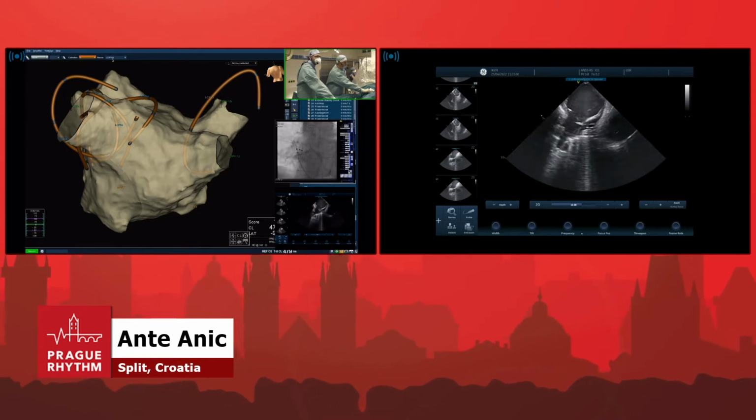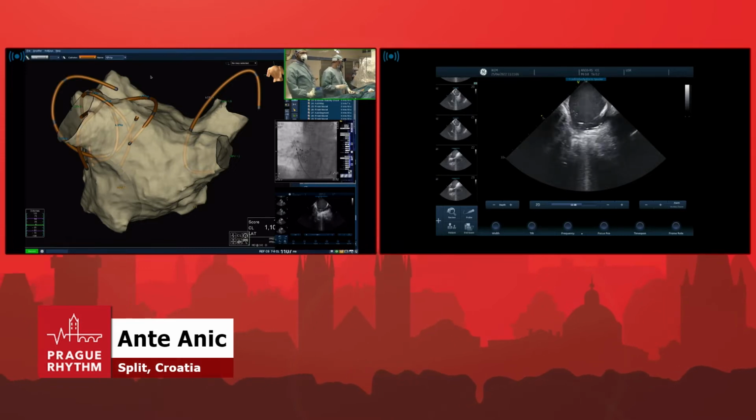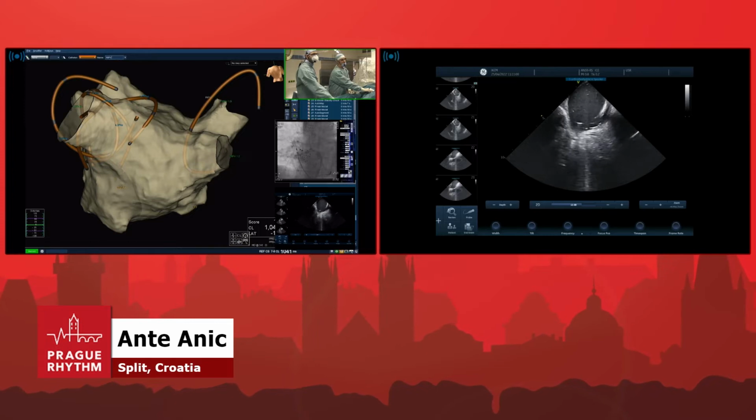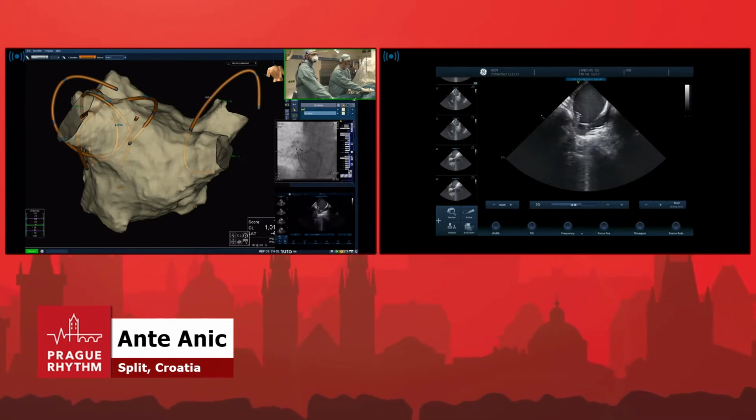So we do see phrenic nerve stimulation, because obviously there's not too much paralytic being given, which is fine. And I like the contact. You see the posterior contact, septal contact. Nice. Go. Right inferior PV, pulse 2.